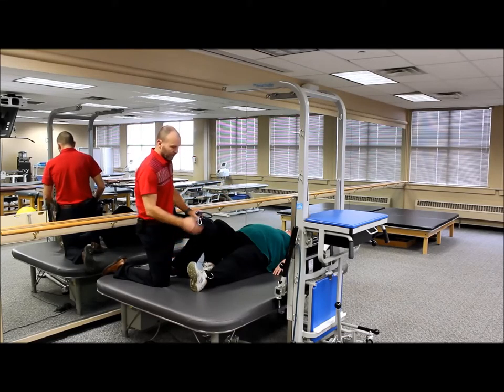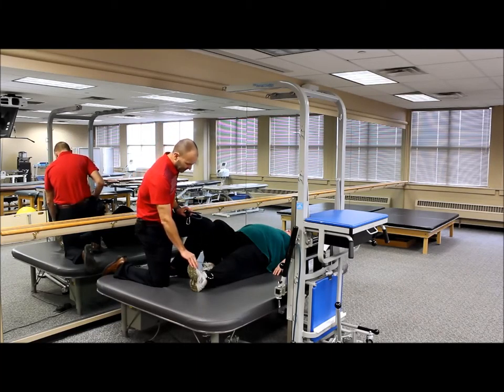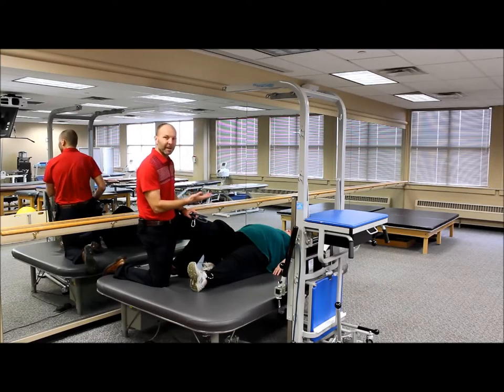You can use this rehab station for various therapeutic exercises, especially when we're talking about assisted exercises that are sometimes difficult to do for patients early on. One of the things that some people find a big challenge initially is just doing a basic straight leg raise.